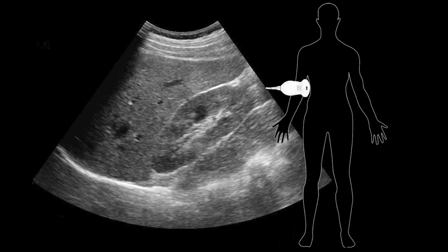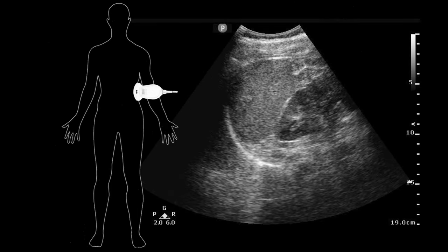In the right upper quadrant we look at the liver-kidney interface — Morrison's pouch — that potential space between the liver and the kidney where fluid gravitationally descends. The nuance is that if fluid is coming from somewhere else in the belly it has to migrate there, so you may first see it at the caudal tip of the liver before it goes into Morrison's pouch. That's where you're looking in the right upper quadrant.